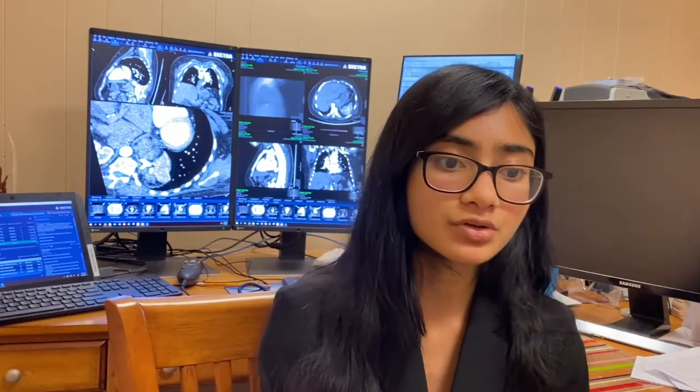The purpose of this experiment is to determine the average hiatal surface area, or HSA, in normal men and women in different age groups. So previously, the HSA was determined either during surgery, under anesthesia, or through cadavers. But in these conditions, the muscles are very relaxed and the HSA will appear larger. I wrote a study about a novel method of using CT scans to determine the HSA, and I thought this was something I could try because, one, I had access to many CT scans through Temple's PACS systems with my connections from a radiologist who works at Temple, and two, this solves the problems that other HSA studies faced because I'd be able to measure the hiatus of a person under normal conditions.